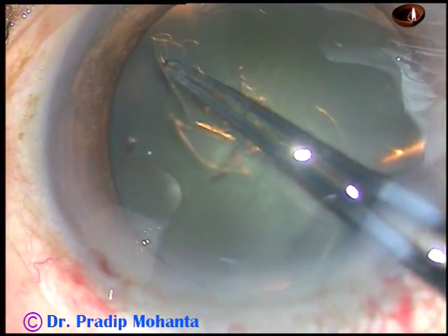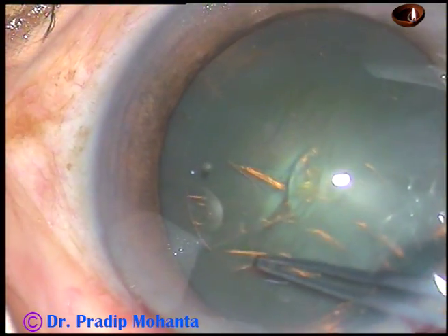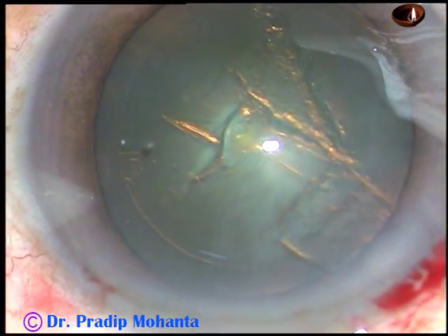And thus I manage to complete a continuous curvilinear capsulorhexis. The rhexis is done.